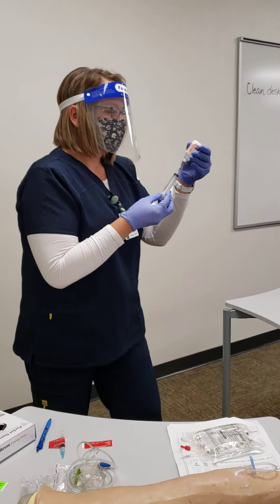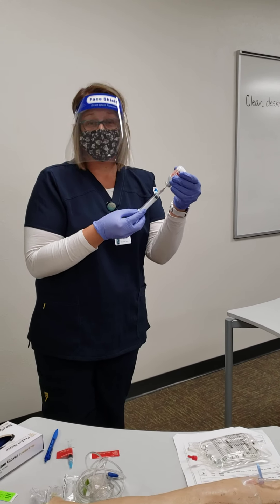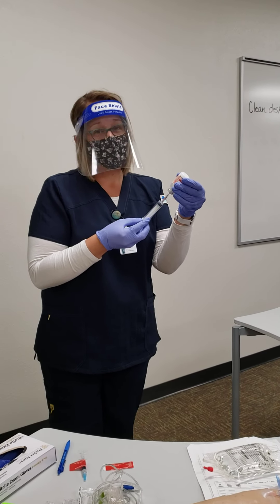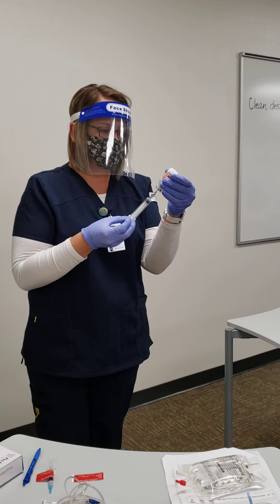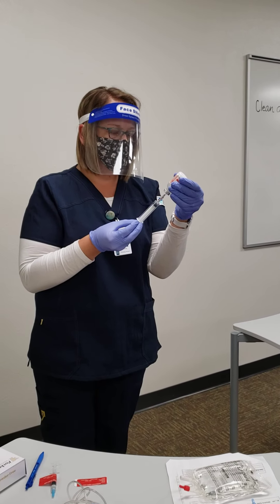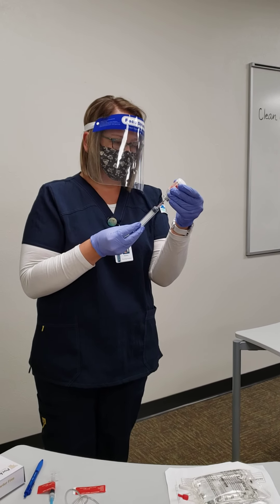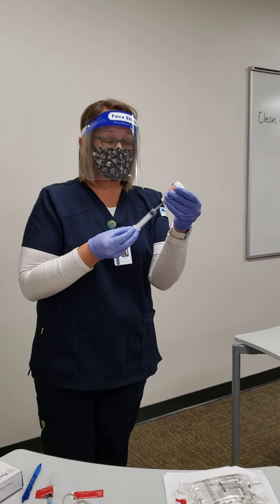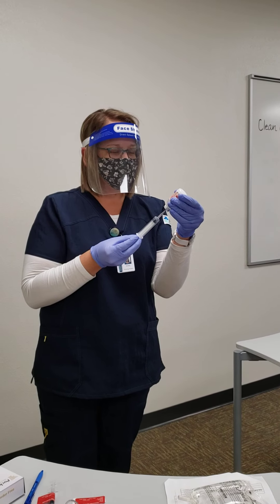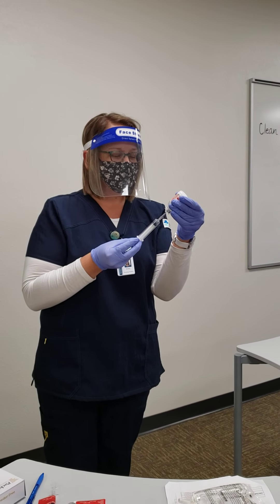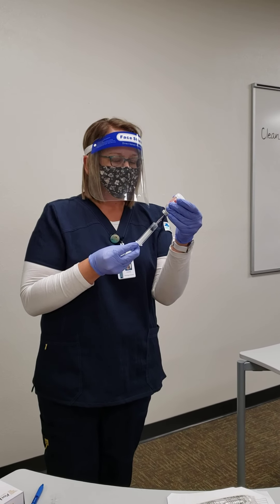The bottle is only dripping because it has been reused — in normal practice we would never do that. And prior to this I would have cleaned the top of the bottle with an alcohol swab as well.